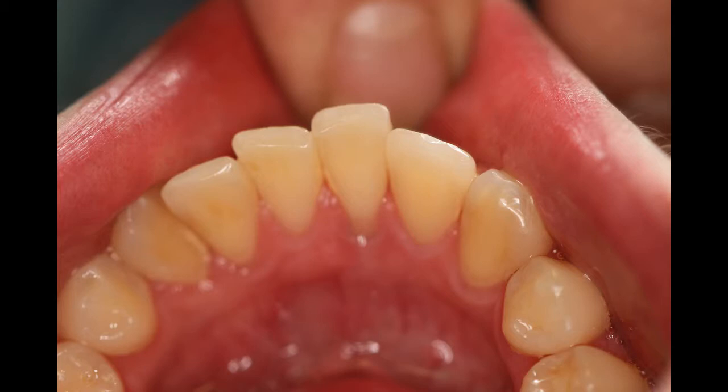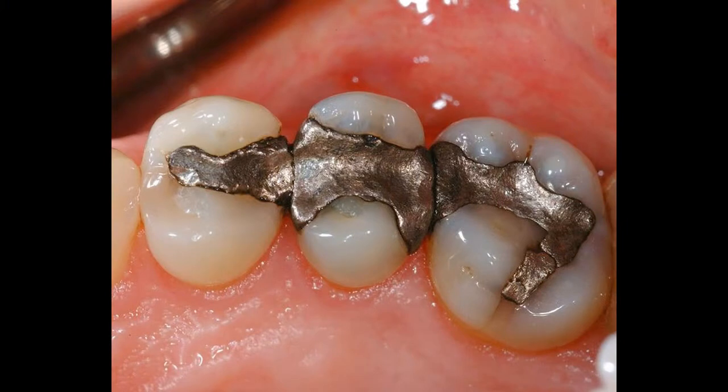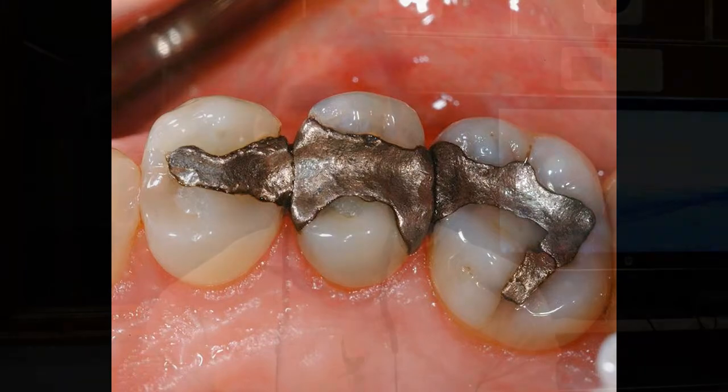The last two pictures are required for the hygienist to take, but they can vary — we're looking for problems. A hygienist can take a picture of a cracked tooth, maybe a 30-year-old amalgam that is failing, maybe a patient has a broken tooth or a cusp that's off. It's up to the hygienist to take those pictures at his or her discretion.